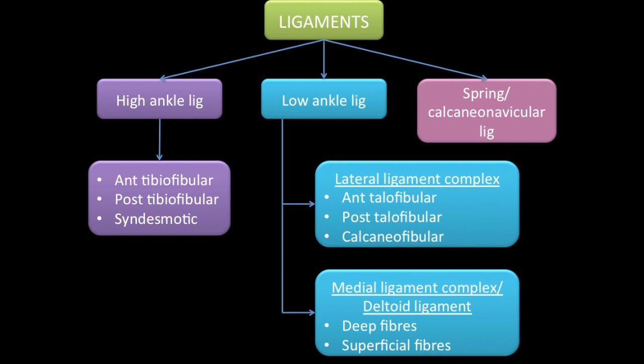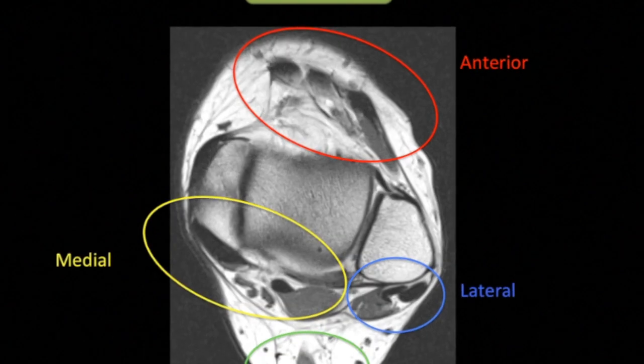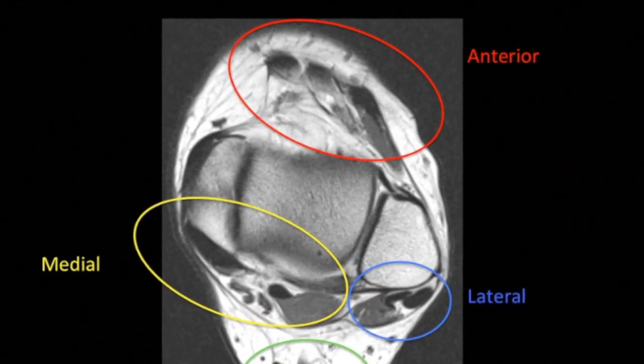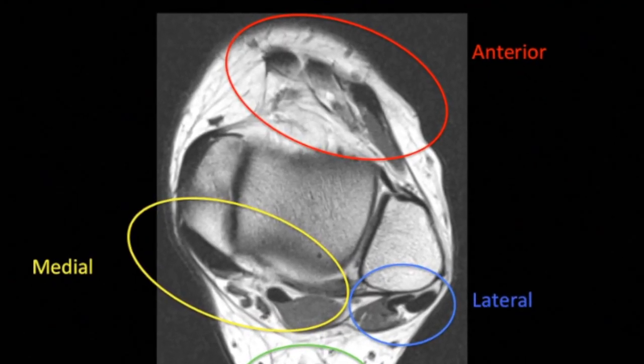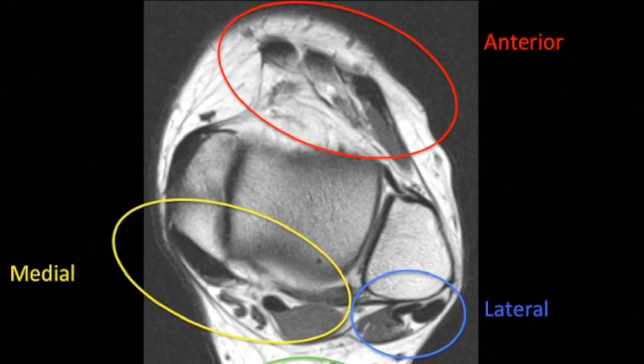Medially is the deltoid ligament which consists of deep and superficial fibers. Tendons can be divided into four compartments: anterior, medial, lateral, and posterior. Now we will look at all of these normal structures on a normal MRI scan in all three planes.